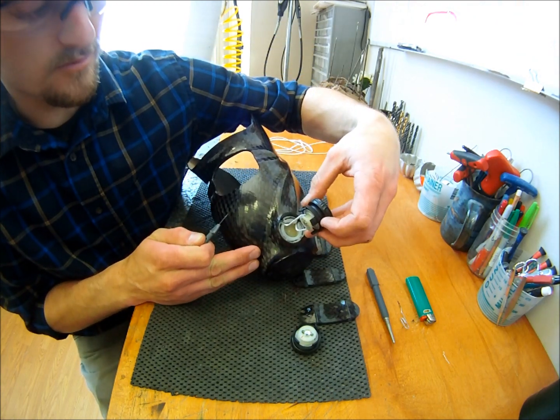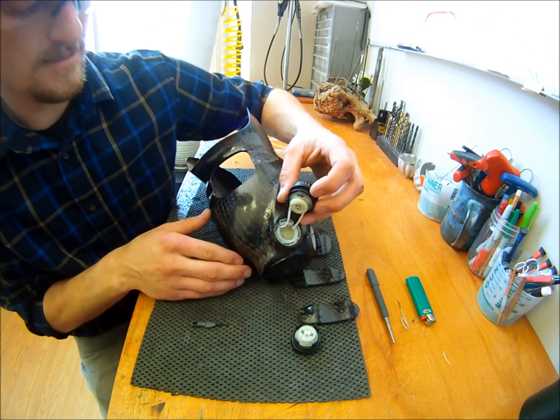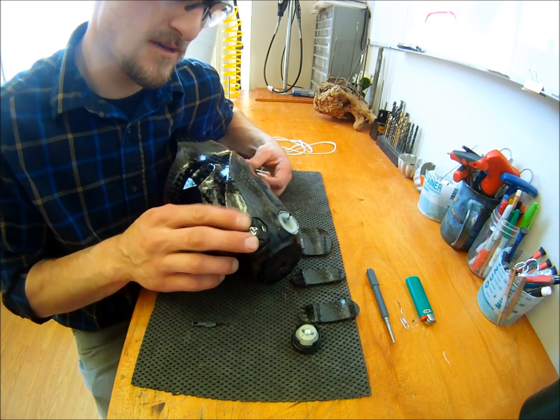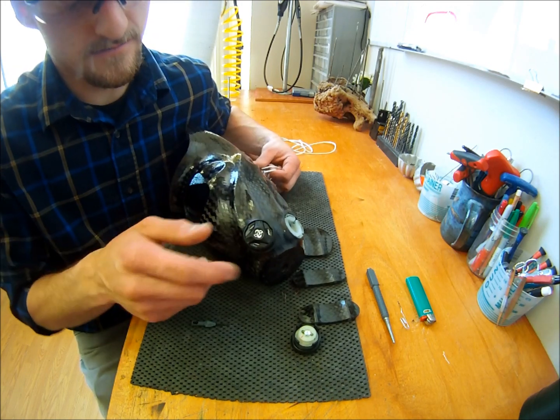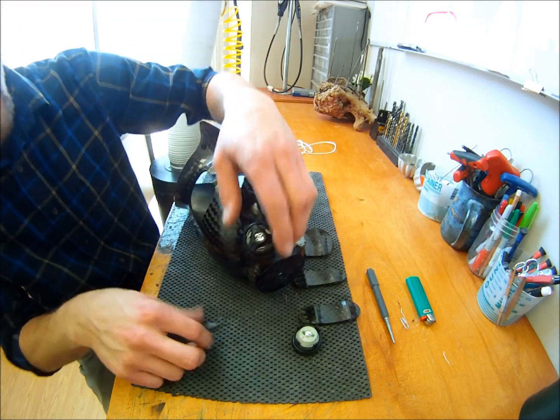You can then twist it, pull it out, to put the dial back in. You want to pull on the strings, straighten everything out, insert the dial, and then turn it counterclockwise to lock it.